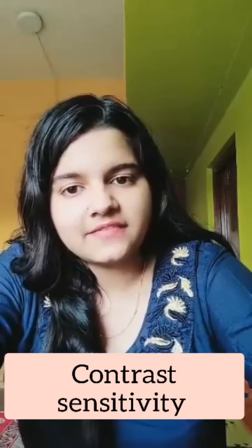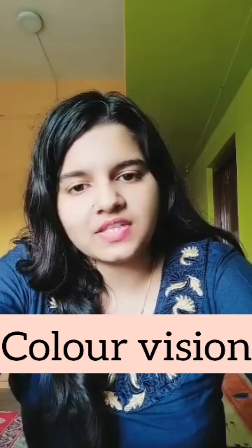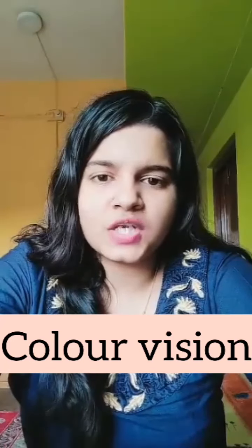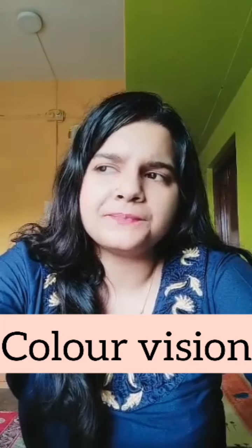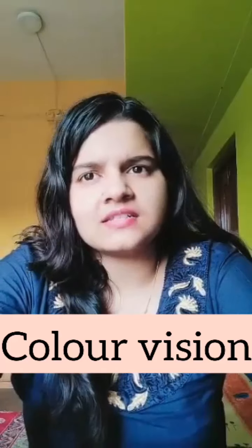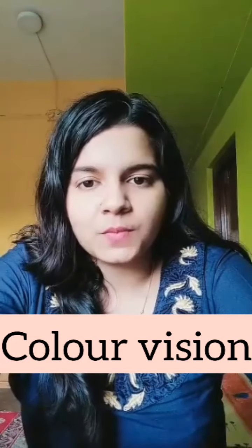After contrast sensitivity, let's move towards the color vision testing. This basically reveals the amount of difficulty the patient might be facing in doing all the tasks that require color formation, for example matching clothes, or recognizing traffic signals. All these things would be very difficult if we have a problem with our color vision. So Ishihara pseudoisochromatic color plates are used while doing the testing of color vision.